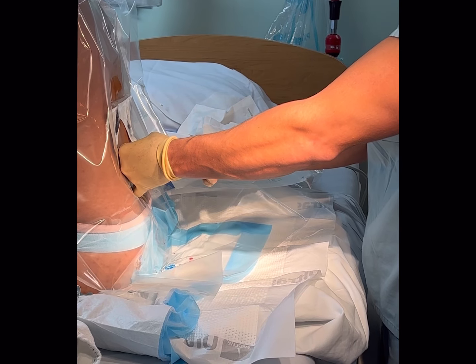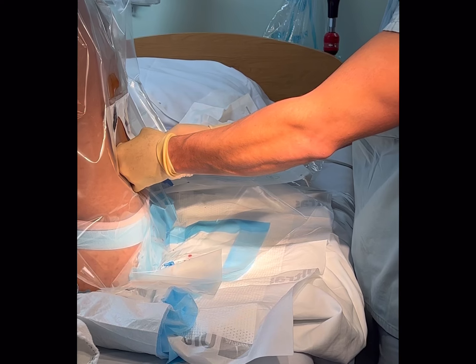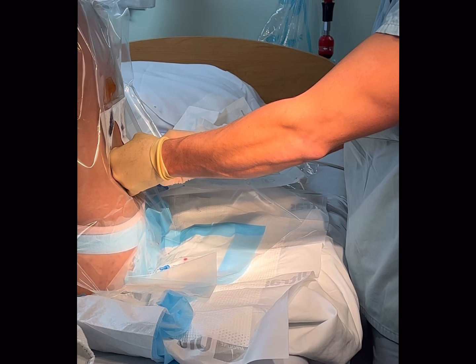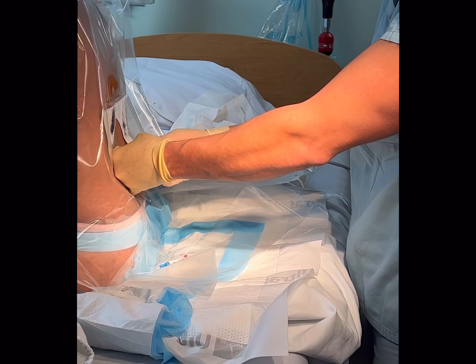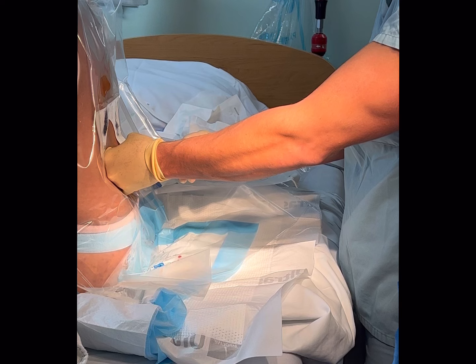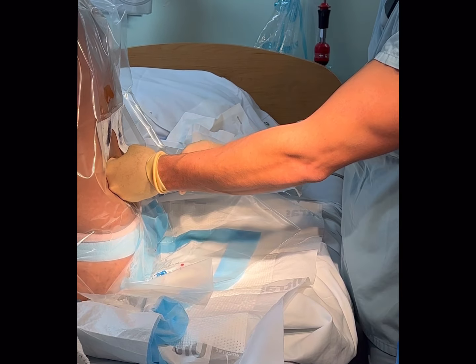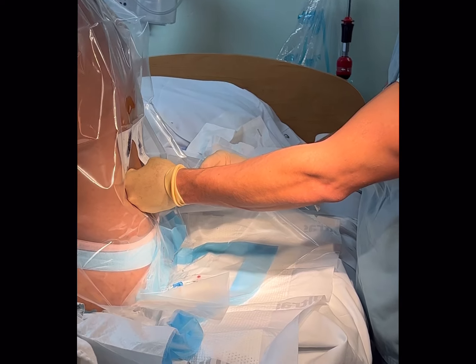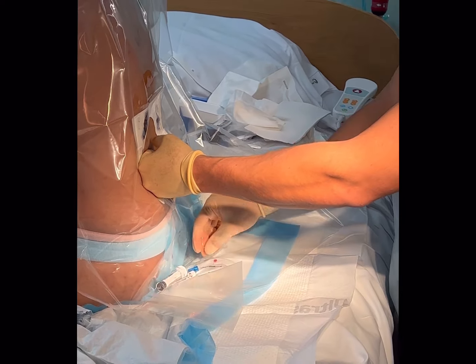I'm just working the space here because I keep hitting bone — it could be her positioning, it could be her anatomy. I seem to be midline, but sometimes you just have to work it. Now I feel like I'm in ligament. I feel the crunch. So I'm going to go slow — you can almost hear the crunch. And this is going to be my loss of resistance. I felt it — it takes the saline so easily. We're in.